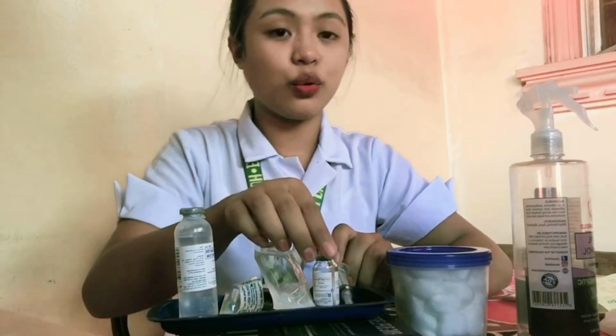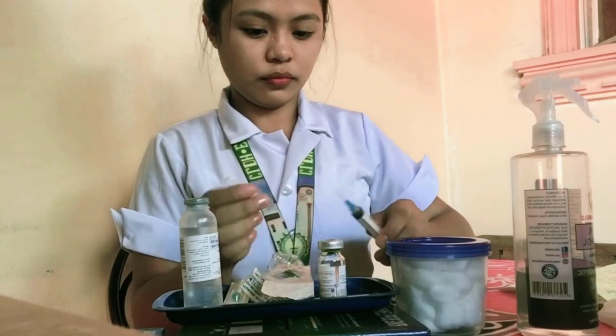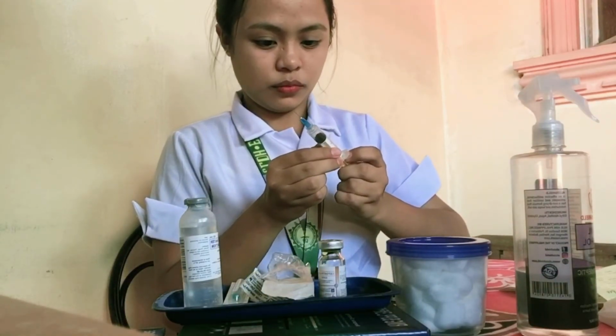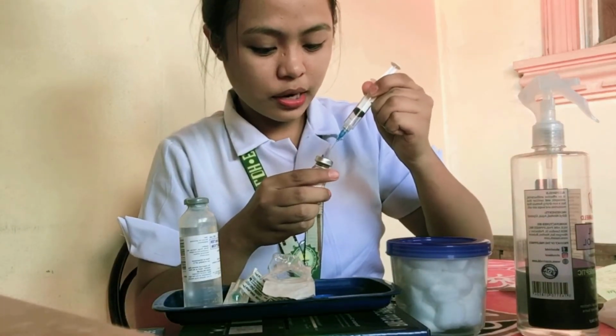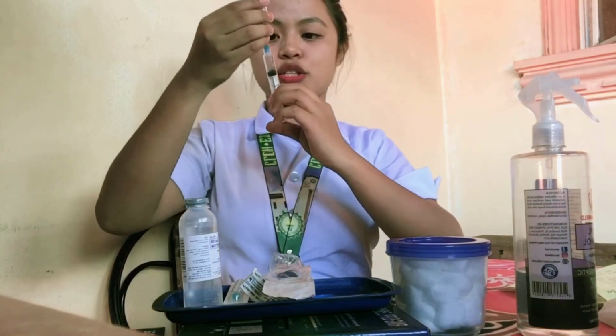Let's assume that we need to inject 2 ml of the powdered vial. So now we need to get 2 ml from our vial. We inject at the center of our vial carefully, and we need to get 2 ml.